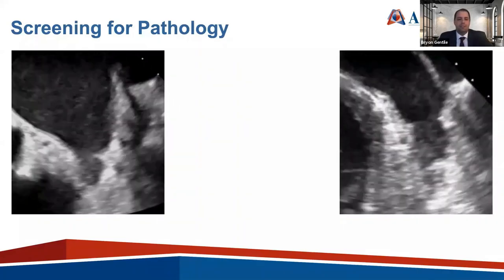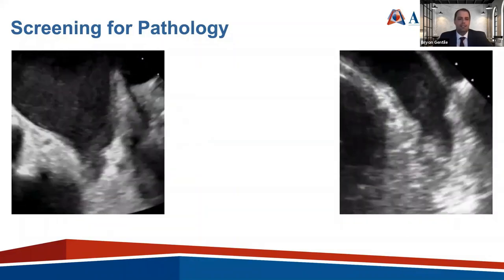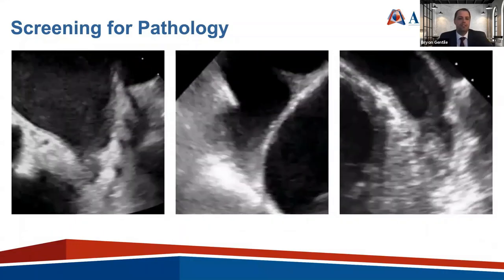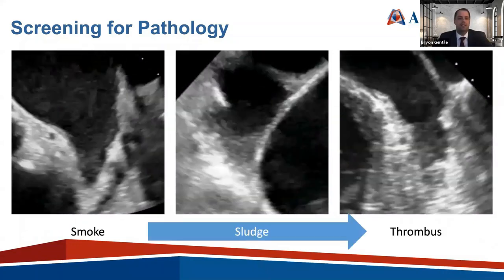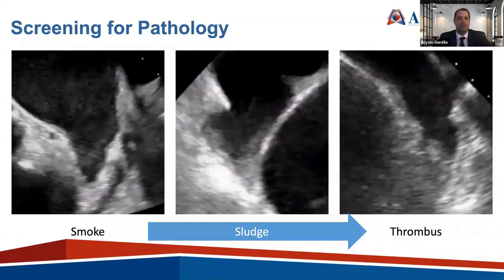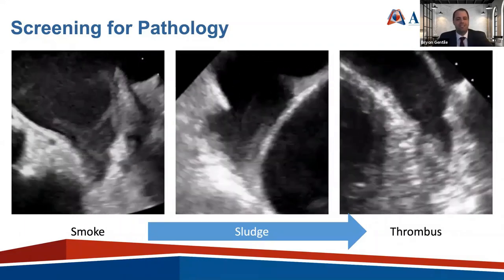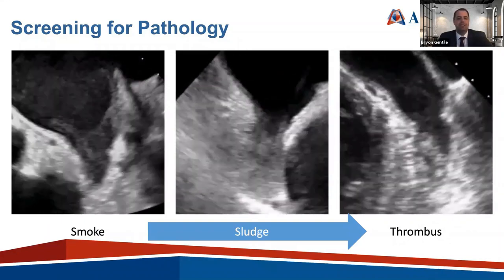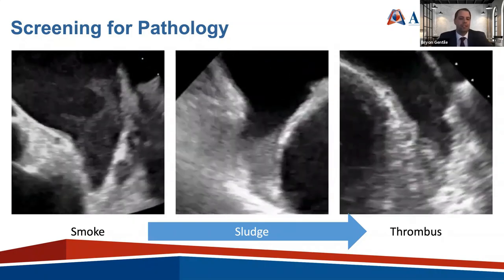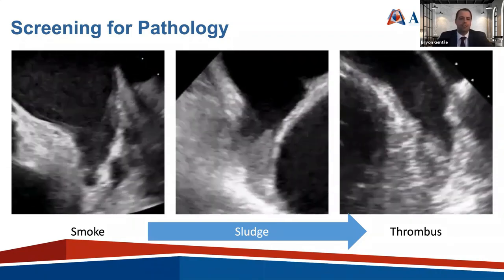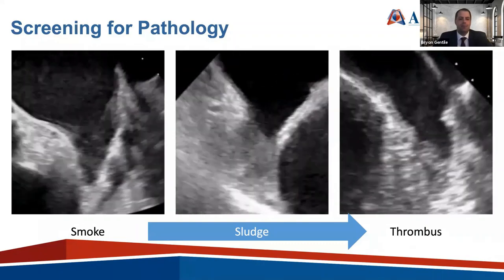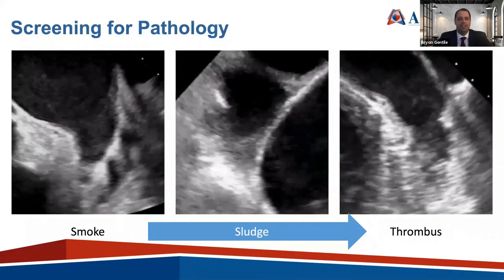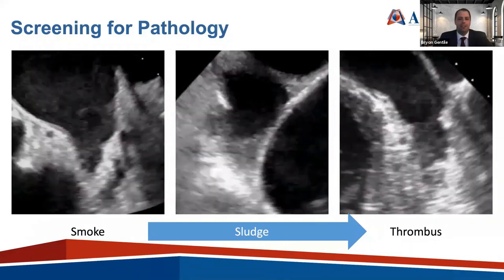This is what's termed in the literature as sludge — similar to spontaneous echo contrast but more viscous and gelatinous, carrying a higher risk of thromboembolic events. When fellows ask whether we can just turn on 3D and look down the barrel of the appendage to determine if it's thrombus, looking at the patient with smoke shows a clear appendage, while thrombus is very clearly visible. But with sludge, it's difficult — I can't entirely exclude thrombus.